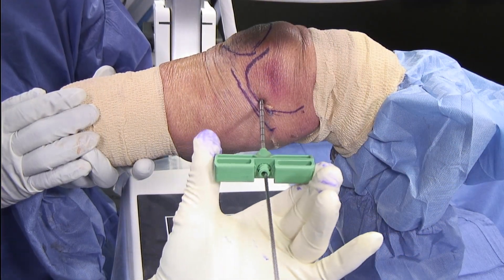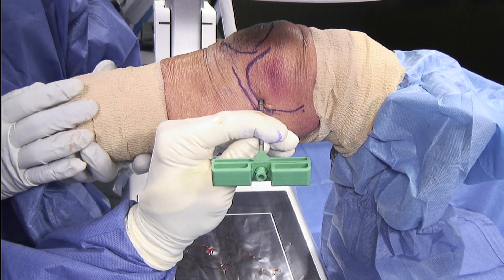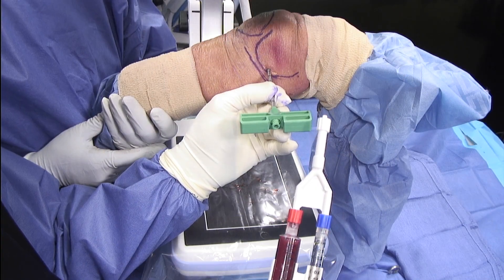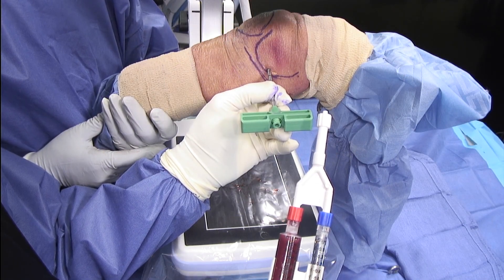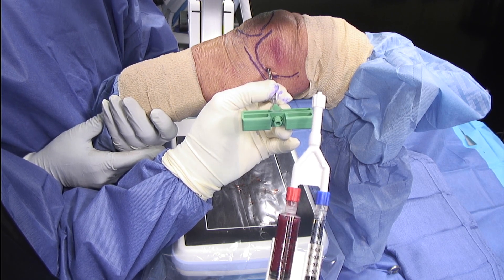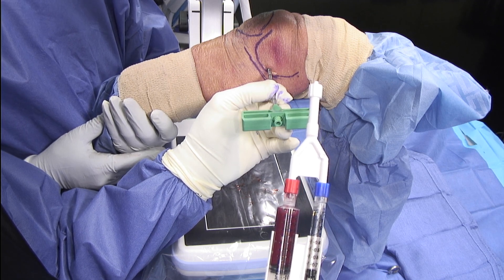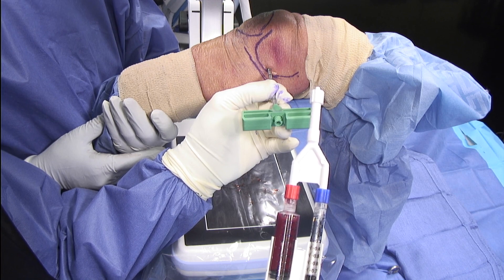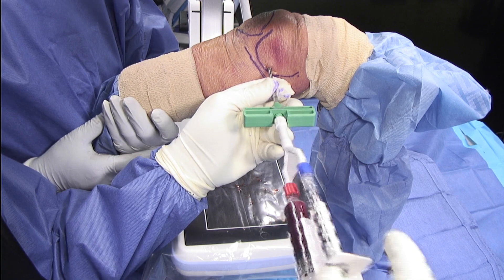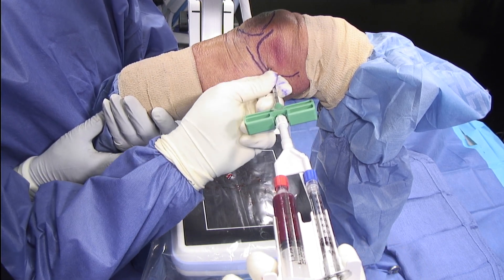The guide pin is now removed and the delivery cannula is stabilized with my hand against the femur. I like to get one image here to confirm that I'm still in position. Bone marrow aspirate was then obtained through the standard fashion and concentrated in the ANGEL system. We transferred it into this viscous applicator where we have the bone marrow concentrate on the left side and a calcium chloride thrombin mixture. This allows us to form a clot within the previously decompressed lesion so that we do not lose our bone marrow concentrate once we remove our delivery cannula.